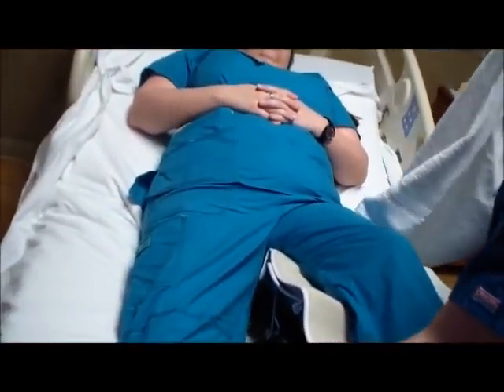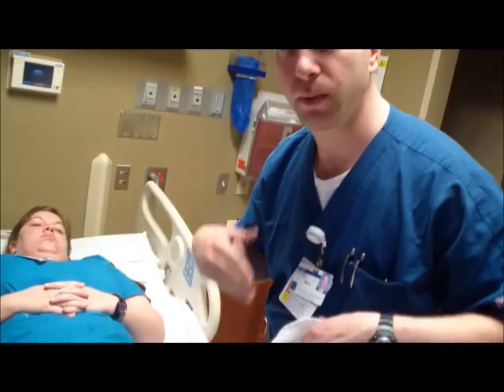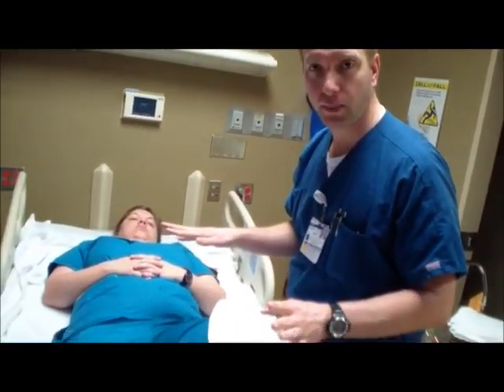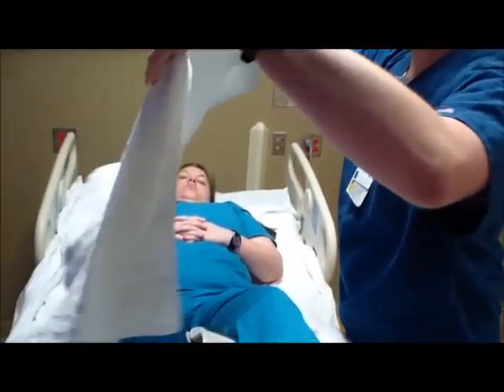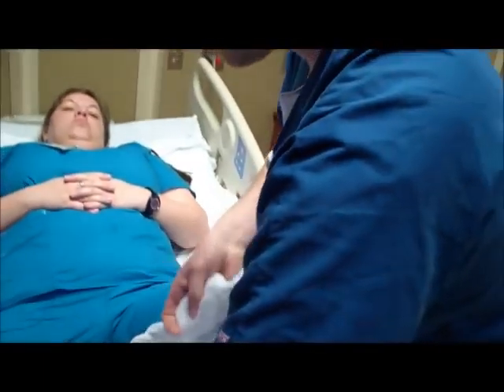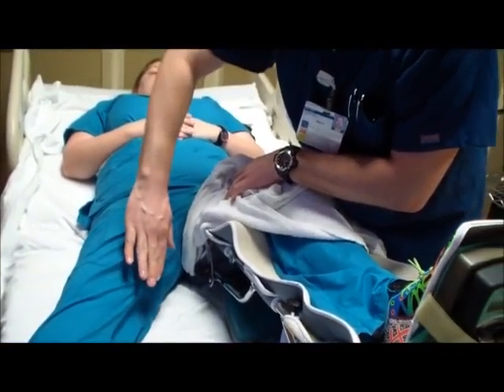Can you go ahead and bring your leg out a little bit? There we go. Same thing, sometimes you'll see it already uncovered, and you can see it's already pushing into her leg. We'll make sure that we don't have anything else going on. Our primary concern is making sure we take care of this knee, that we have nothing else happen, because if we start having skin breakdown on top of this, it's another aspect that could make the patient stay longer in the hospital. So we're just going to unfold our towel right in the crease there. And you have some buttons here that could also cause skin breakdown, so you want to make sure you cover those as well so it's not rubbing on the other leg.